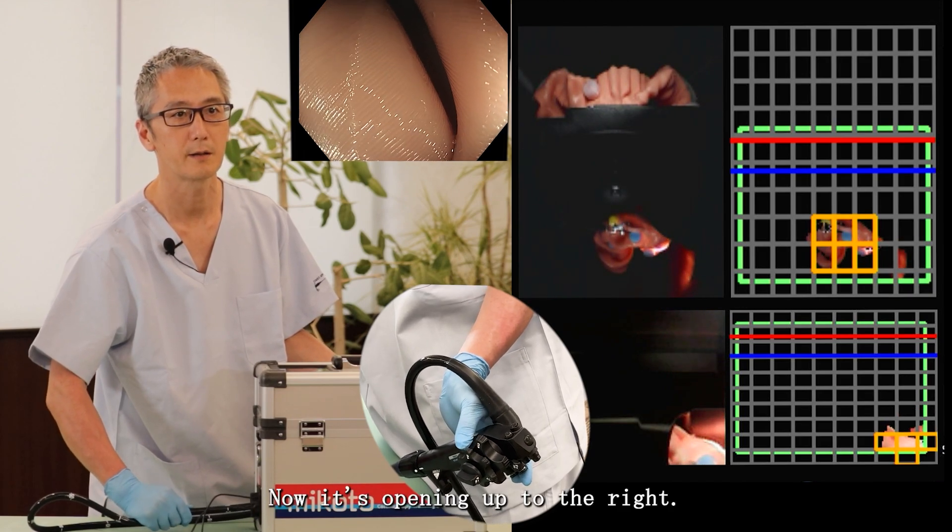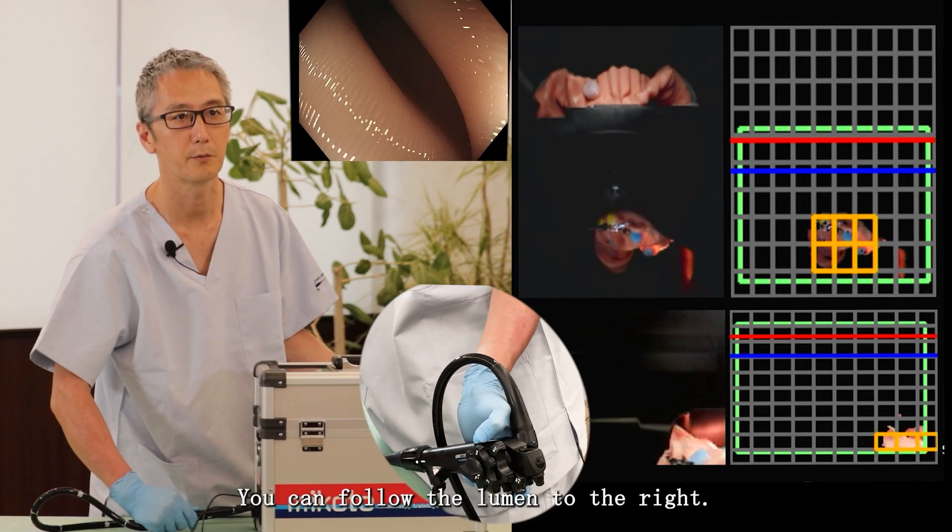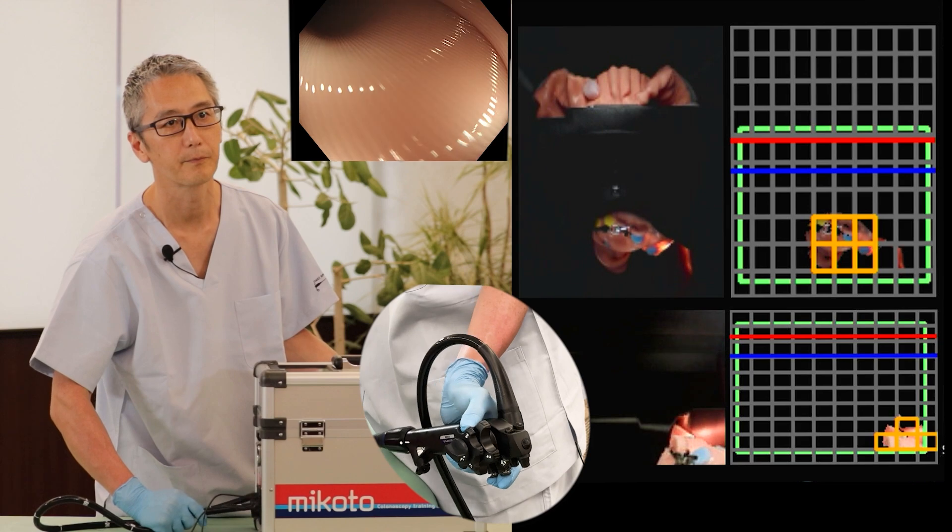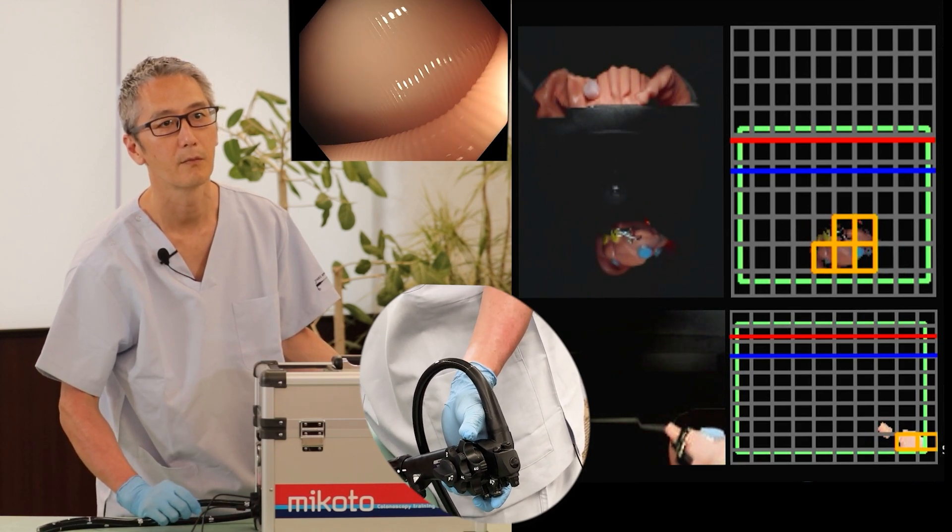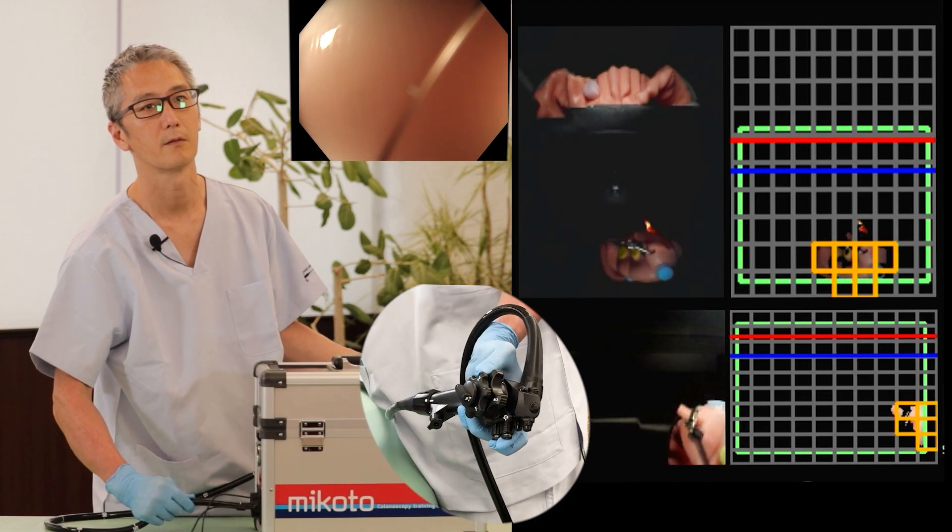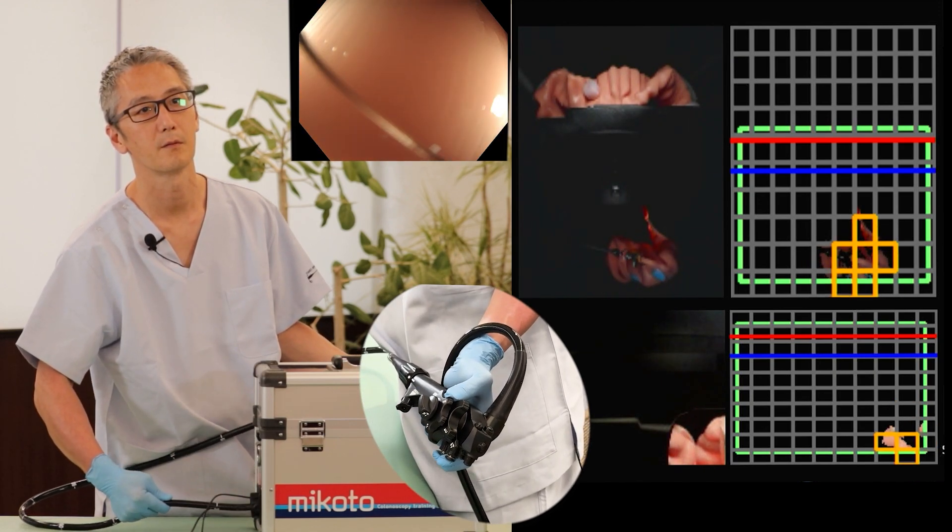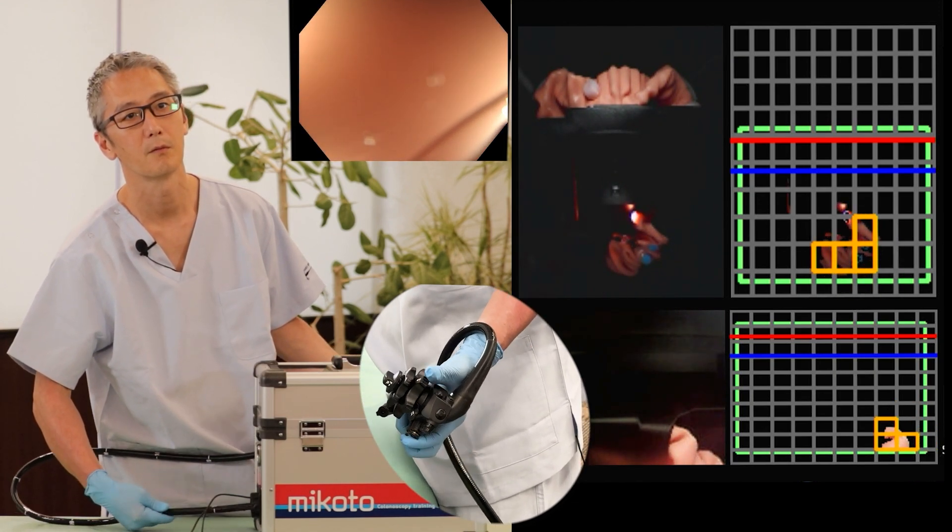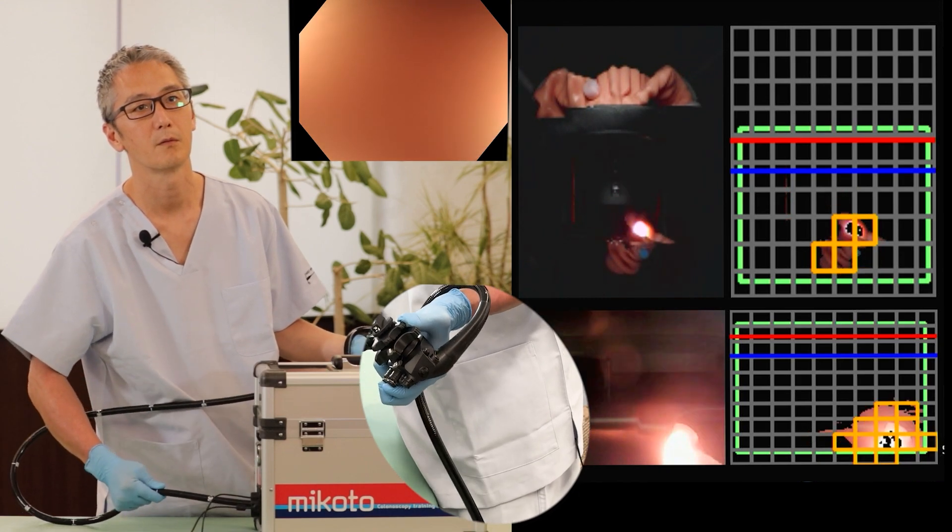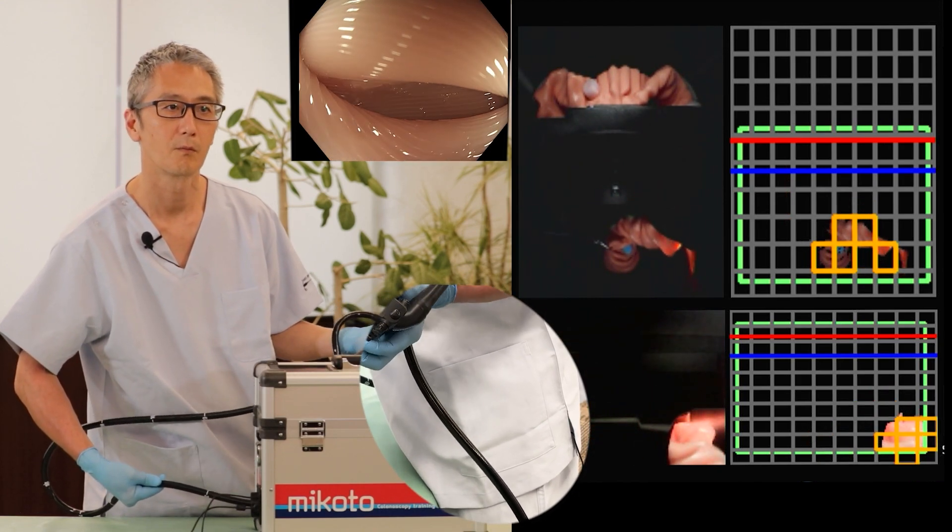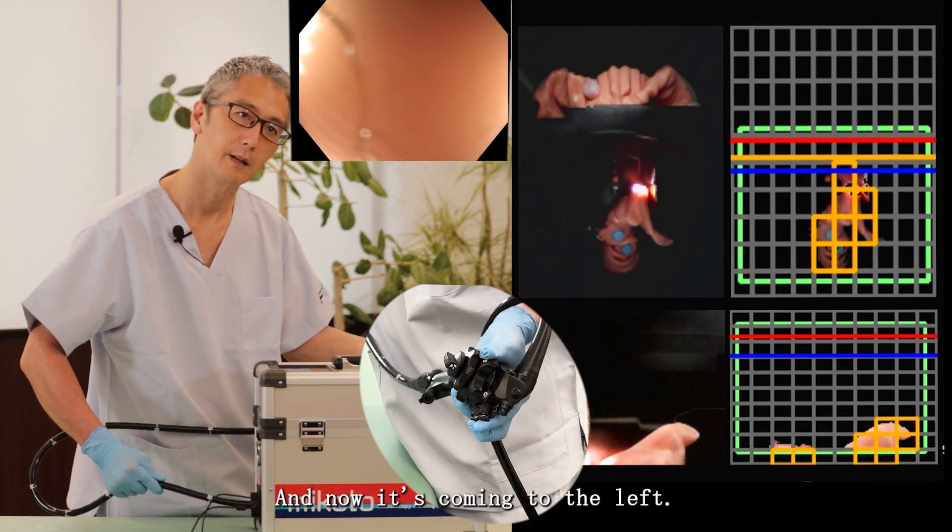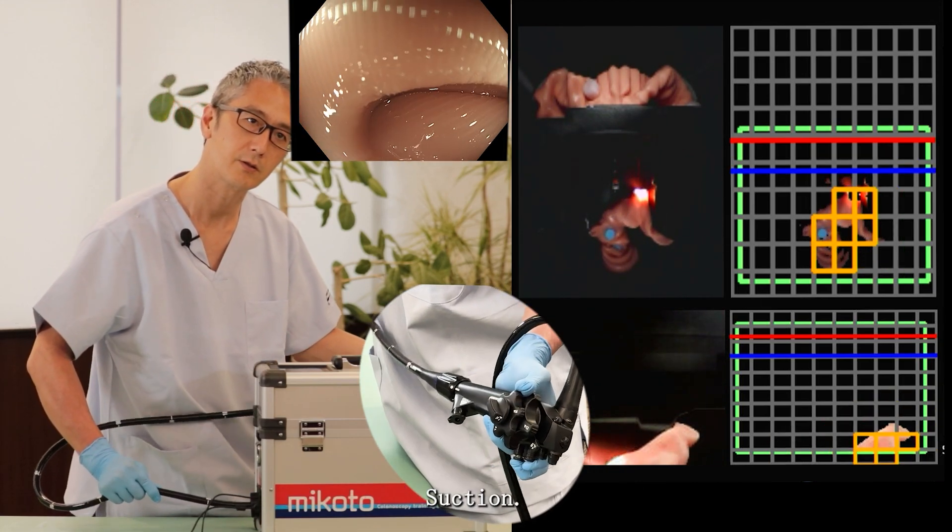Now it's opening up to the right. You can follow the lumen to the right. Again, now it's coming to the left, suction.